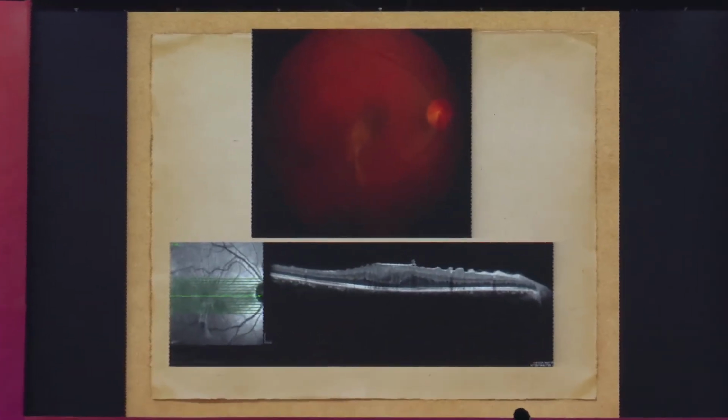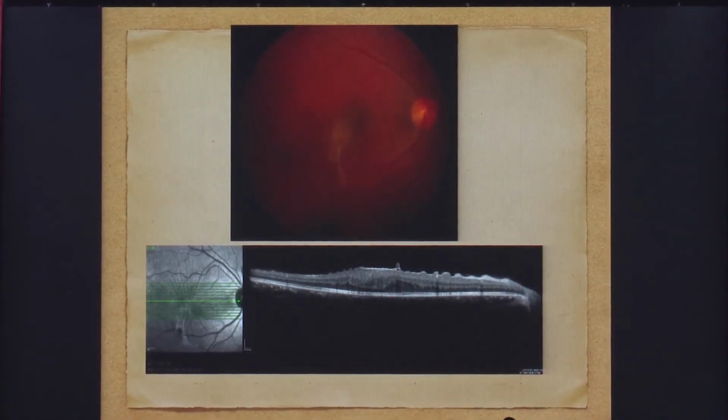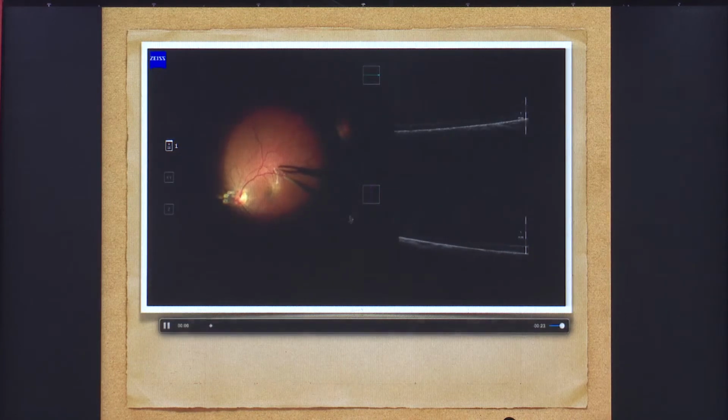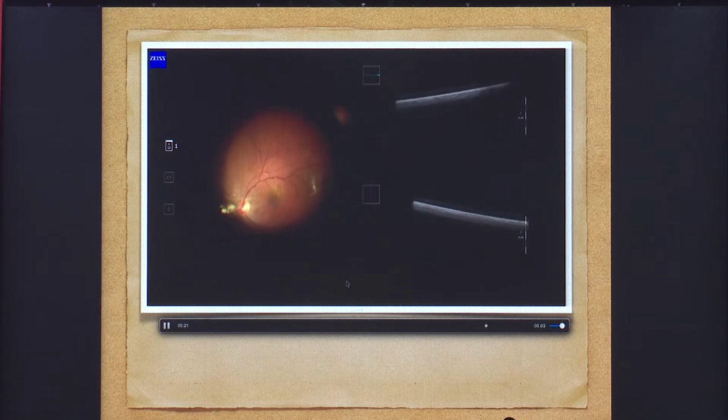This is one example I wanted to show, an ERM which I have taken up for surgery. I have a mental picture of an epiretinal membrane, whether it is globally adherent or locally adherent. I go to the OT next and I operate this patient. I know that this is a MIOCT, but I am not running it through the lesion, because I wanted to show what can happen if you don't use the OCT. So I am doing a regular PVD induction, and then it seems that I have done the job, and probably now I'll finish the peripheral vitrectomy and close the case.